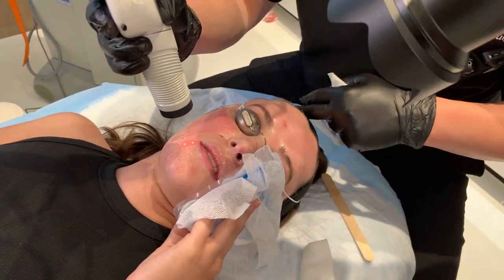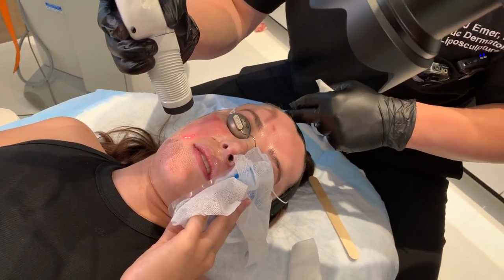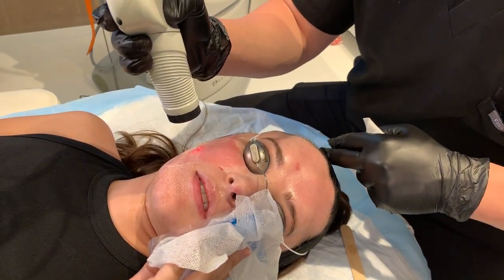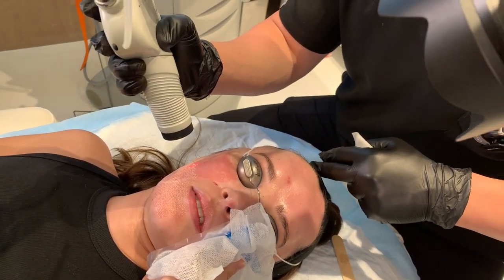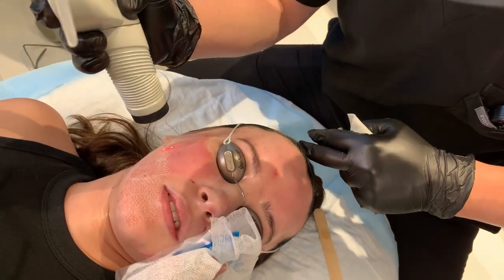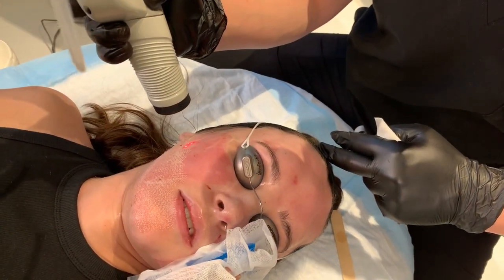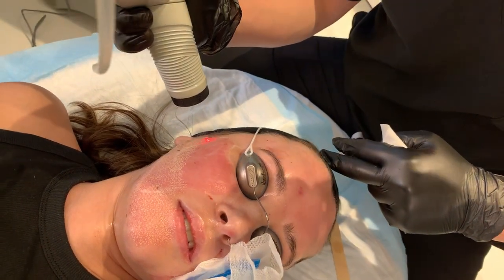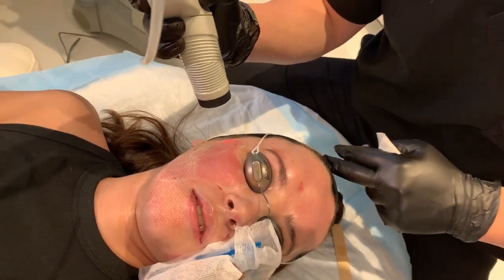The plan would be 8 to 12 weeks from now to just start some maintenance treatment. Fraxel, Moxie, or Halo. Fractora is a microneedling radiofrequency without any downtime. Regular microneedling. Anything. And if we feel we need more Bellafill, we can decide that in 3 to 6 months.